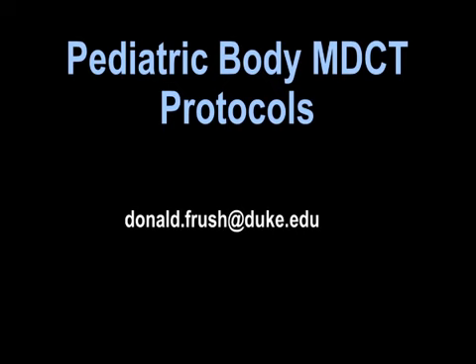Is that not true? So there are two separate issues. One is the technique and the image quality related to the radiation dose, and the other is contrast. With the faster scanners, at least with a dual source, you can get a CTA from the circle of Willis down through the pelvis, no problem. Even if you acquire one, in one time slot and shift around, it is just so fast. So the contrast issue isn't really a significant issue.